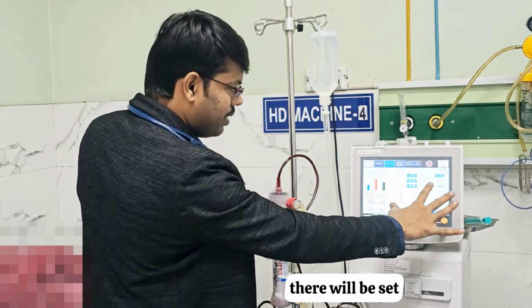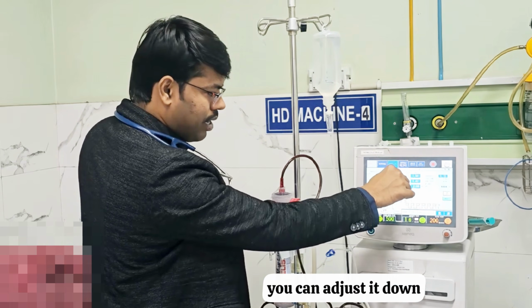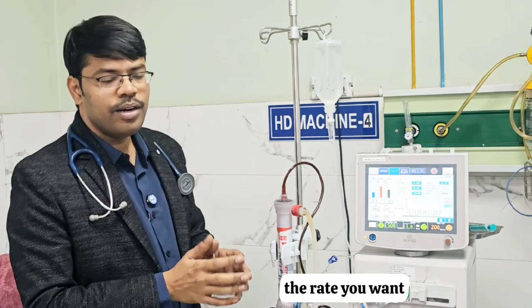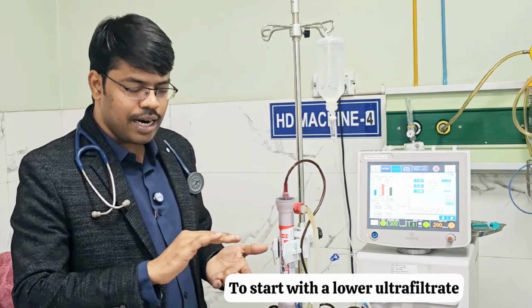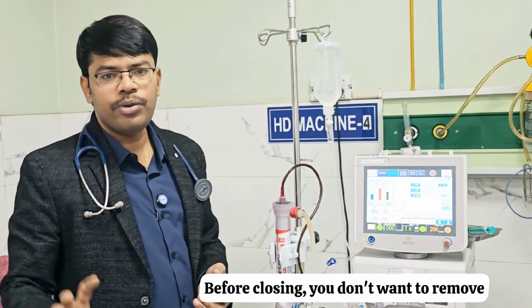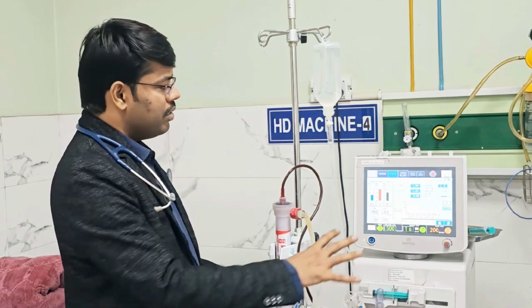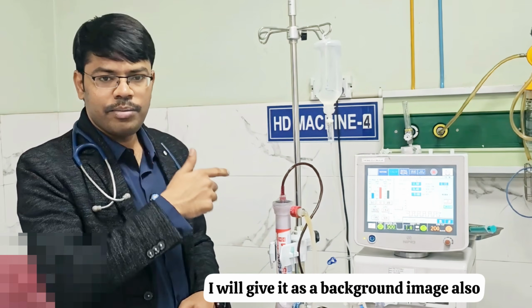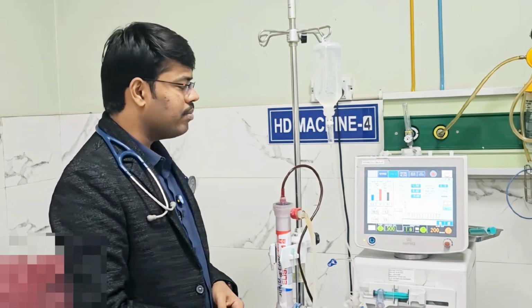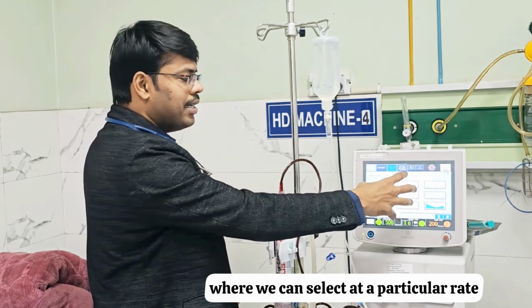Once you touch, the entire set of graph bars will be there. This bar you can adjust up, you can adjust it down. The graph you can make also. Whatever the graph, the rate you want, you can minutely adjust. To start with a lower ultrafiltrate, at the third hour a higher ultrafiltrate, before closing you don't want to remove. Let us take last 30 minutes you don't want to remove. You can set it accordingly. So this screen I will give as a background image also. You can go through what are the parameters. Once I touch this, I can start adjusting the individual bars. And once it is done, we will come back to the bar selection where we can select at a particular rate.